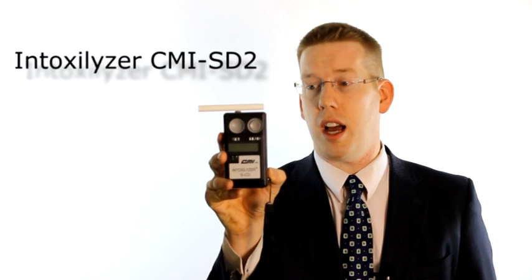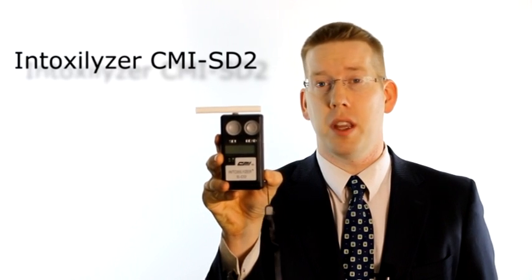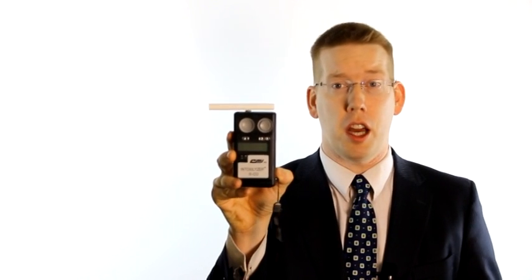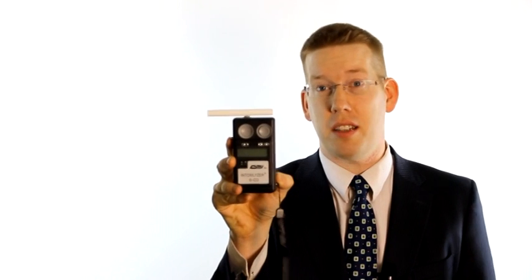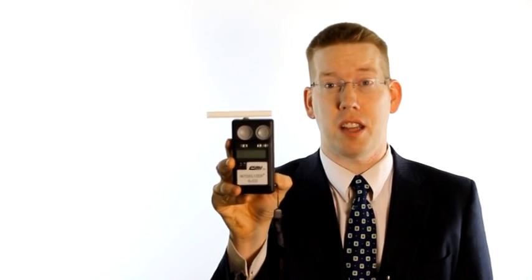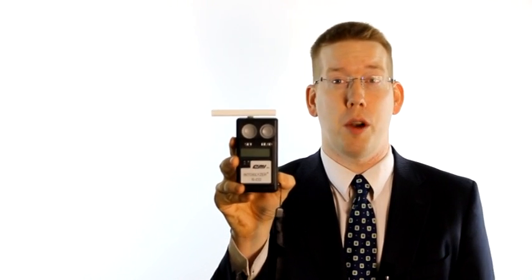Now this device I have here is the Intoxalyzer CMI-SD2. It's the primary field breath testing device used by the Fairfax County Police Department. It's known as a preliminary breath test or PBT.